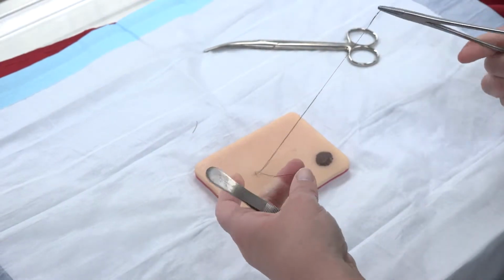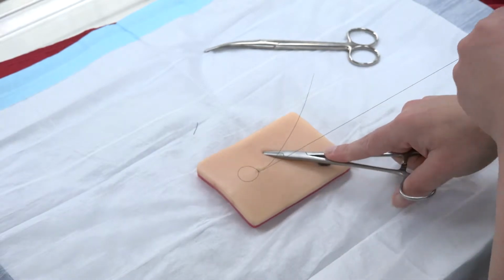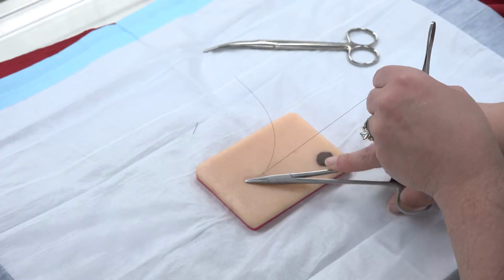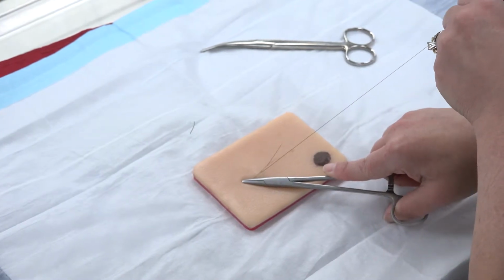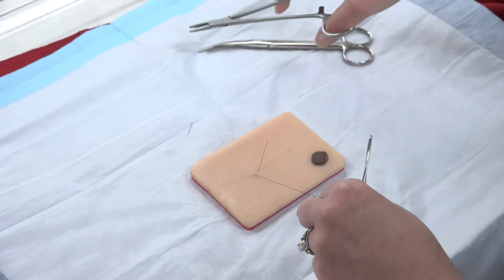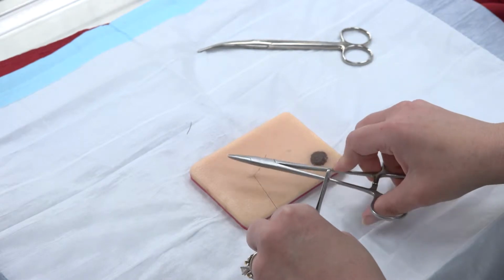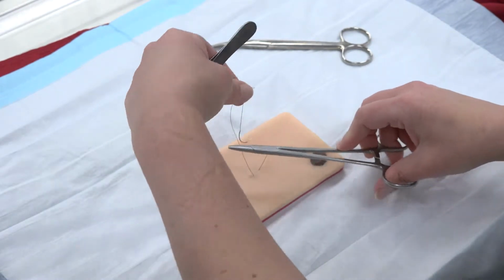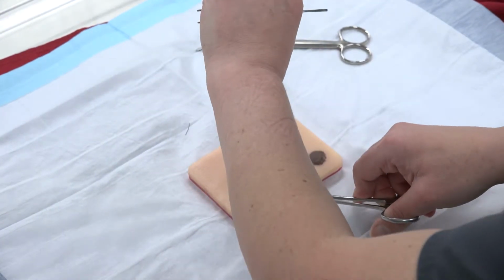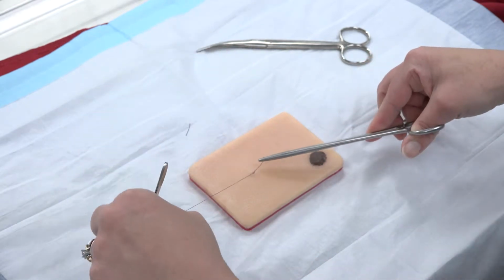All right, now I'm going to look at it again and say, hey, is that where I wanted it? Okay, it is, so I'm going to go ahead and pull it through. So you cannot see that line of the suture, and it's in the holding layer. So now I'm going to pull it to where this guy is manageable. If you have him super long, it's hard to make that knot. So I'm going to make him manageable, put my needle holders in the middle, go over the top, grab my end, and pull. Middle, over the top, grab my end, and pull.